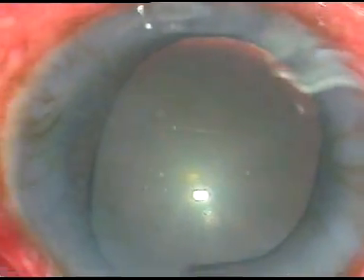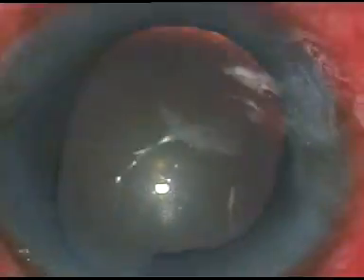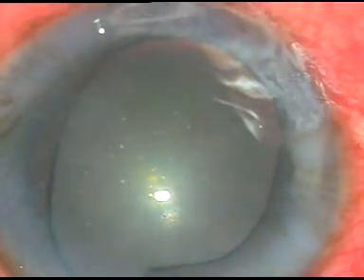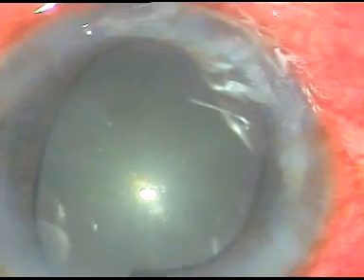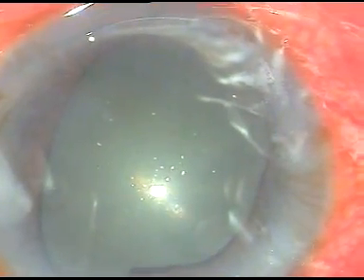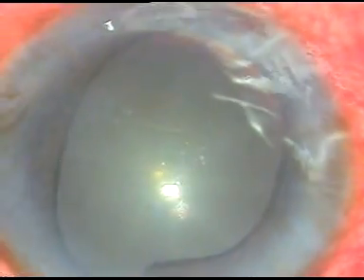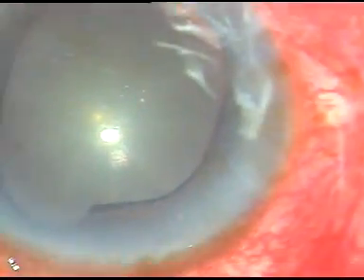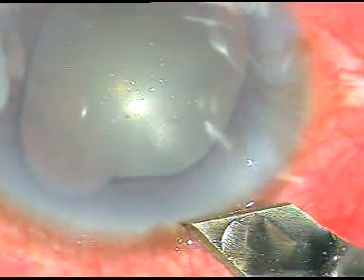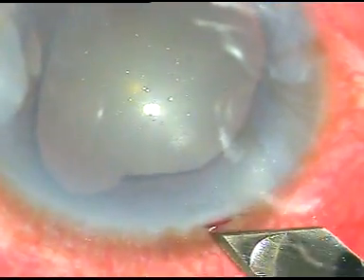Dear colleagues, this is an almost unedited video of clear lens extraction with IOL implantation for acute angle closure glaucoma. This patient had an attack of acute angle closure glaucoma 10 days ago and he received all anti-glaucoma medications, but intraocular pressure is not controlled. IOP before medication was 60 mm of mercury, and with medications it has come down to 40 mm of mercury.